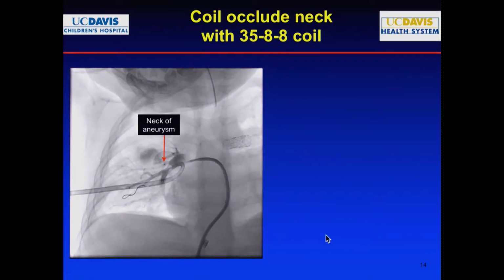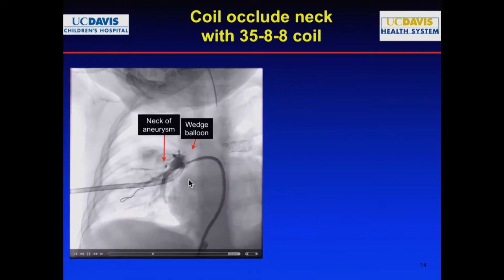Now remember, there's a principle in general surgery. When you have a bleeding in the GI, first of all, you manage the vital signs, resuscitate the patient. The second is to find the source of bleeding, and then you manage that, right? So in the same way, that principle can apply to interventions. You find the source of bleeding. Where is it located?